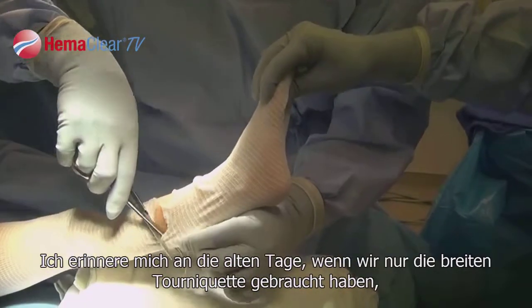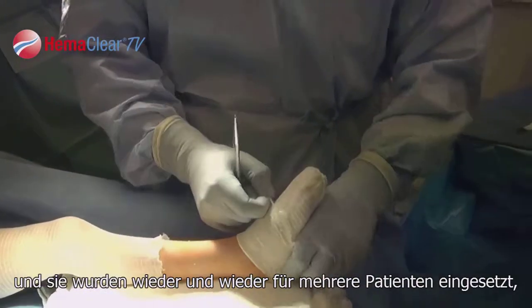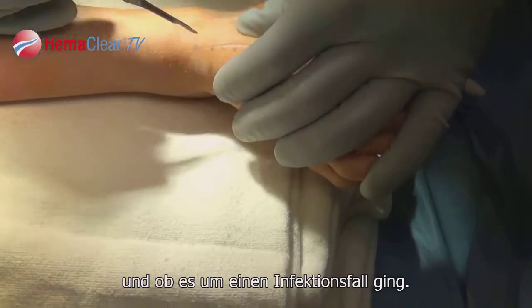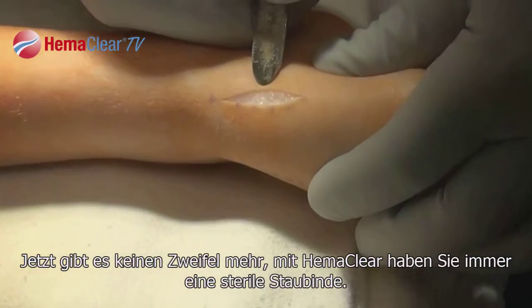I remember in the old days when we were using wide tourniquets and they would be used over and over on multiple patients, and you kind of wondered which patient had that tourniquet on their leg before your patient and whether or not they were an infected case. So there's no question — with the Hemoclear you're getting a sterile device every time.